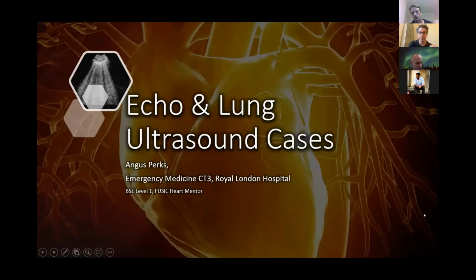So I'm just going to talk through some cases. I'm not going to try and teach too much on techniques, but I'll talk through a couple of things as we go. I'm obviously biased because I love ultrasound. I think it's great, but I think it's just a tool. It's not the be all and end all.